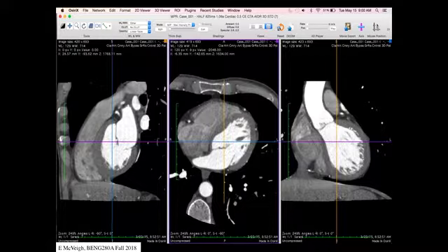Okay? The patient's lying on a table. We're now cutting something parallel to the floor, and this is what it looks like. So now we can see the aorta coming up from the left ventricle and get a view of the aortic valve. This is right ventricle. Here's the patient's diaphragm. And so you get another view of that patient from a different orientation.